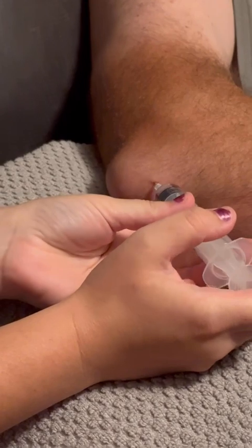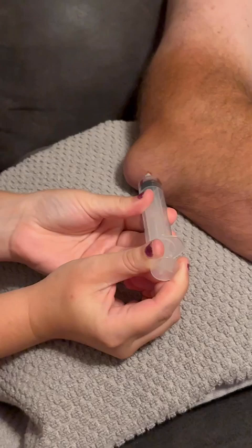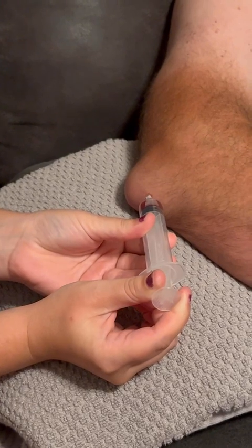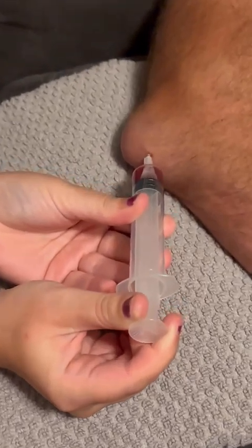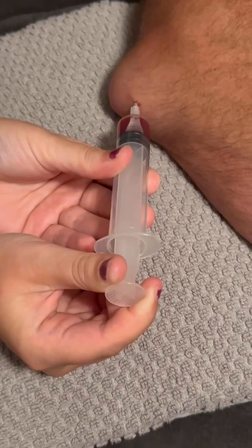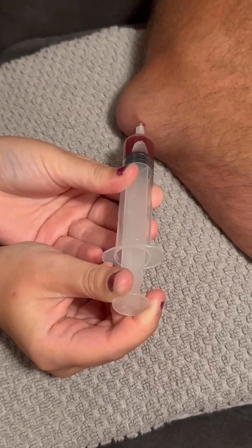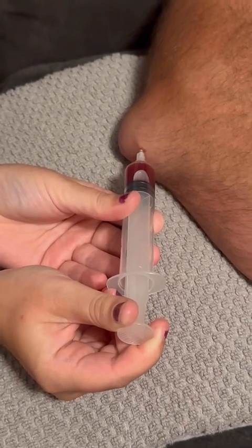The other videos we saw had — it looks like blood. Are they going down at all? Look at all the stuff you pulled out of it already. So you're filling it up. Is that blood? No, it's not blood. It's like watery — it's too watery to be blood. There's some blood mixed in it, but it shouldn't be that liquidy.